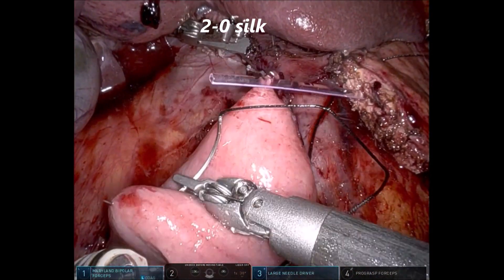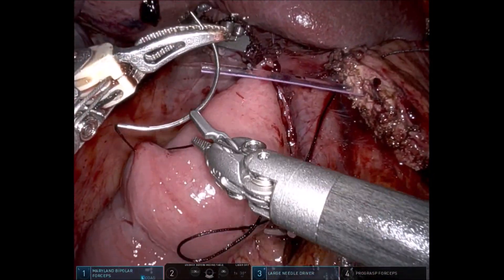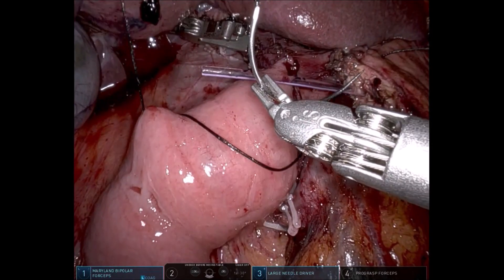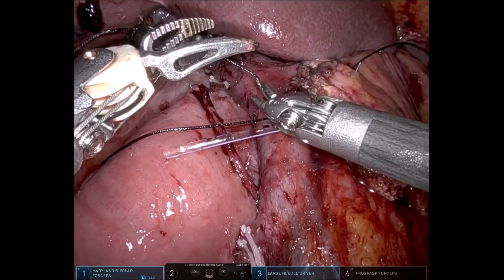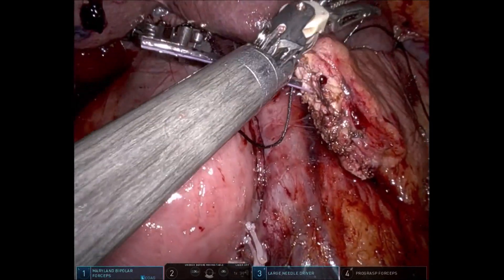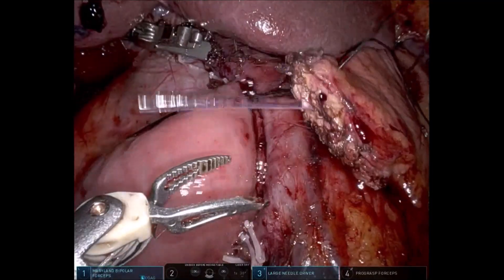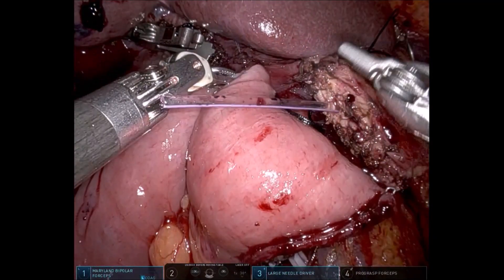A 2-0 silk suture is taken through and through on the cephalad side of the pancreas, across the transected pancreas. A seromuscular bite is taken in the jejunum, and then through and through back from posterior to anterior of the pancreas, completing the first Blumgart stitch.